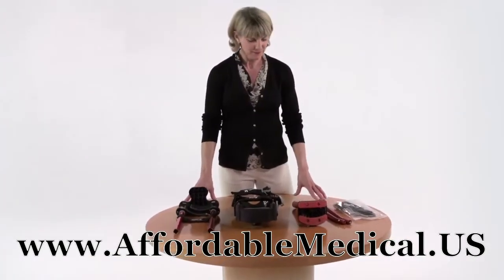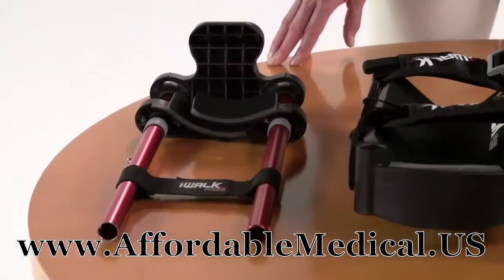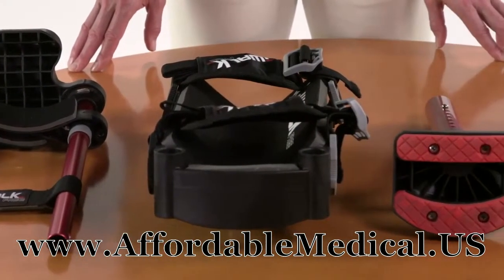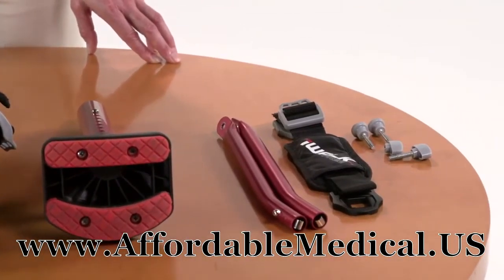First, let's separate and identify the parts of your iWalk. This is what it looks like when you take it out of the box. You'll notice that the iWalk has three main sections, two support tubes and a bag of loose parts.